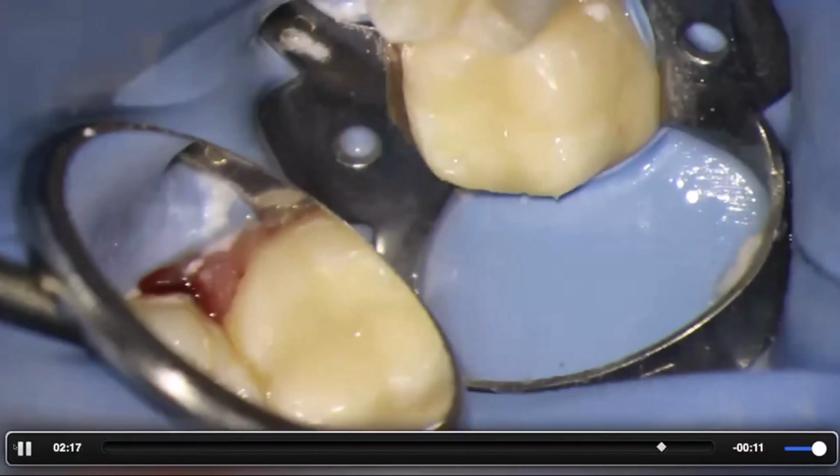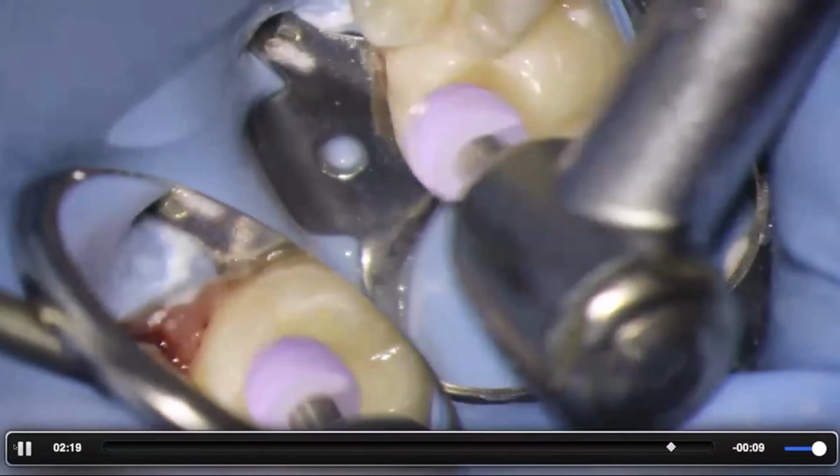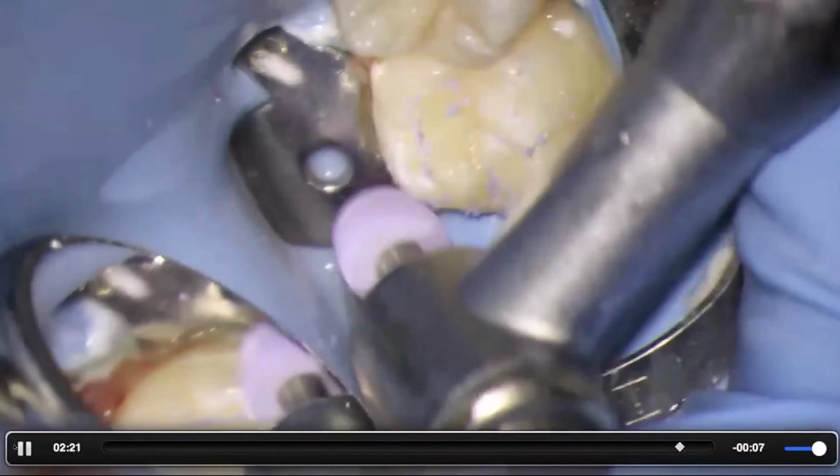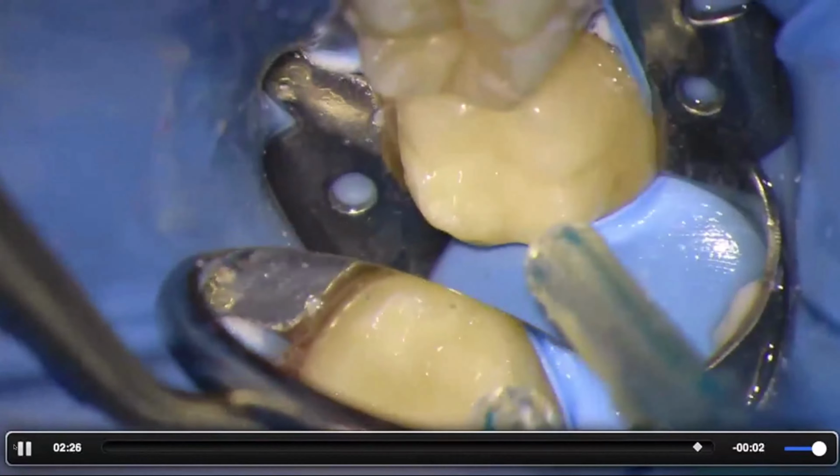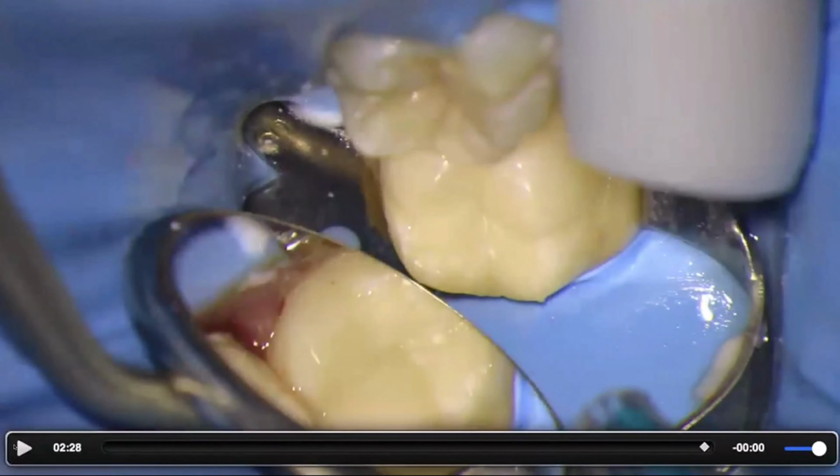I'm using a white football. I'm not going into my anatomy. I'm just kind of smoothing everything off. And this is just a rubber wheel and rinsing, and you get an idea. It's not perfect, but it looks decent. It'll suit this patient for a while.